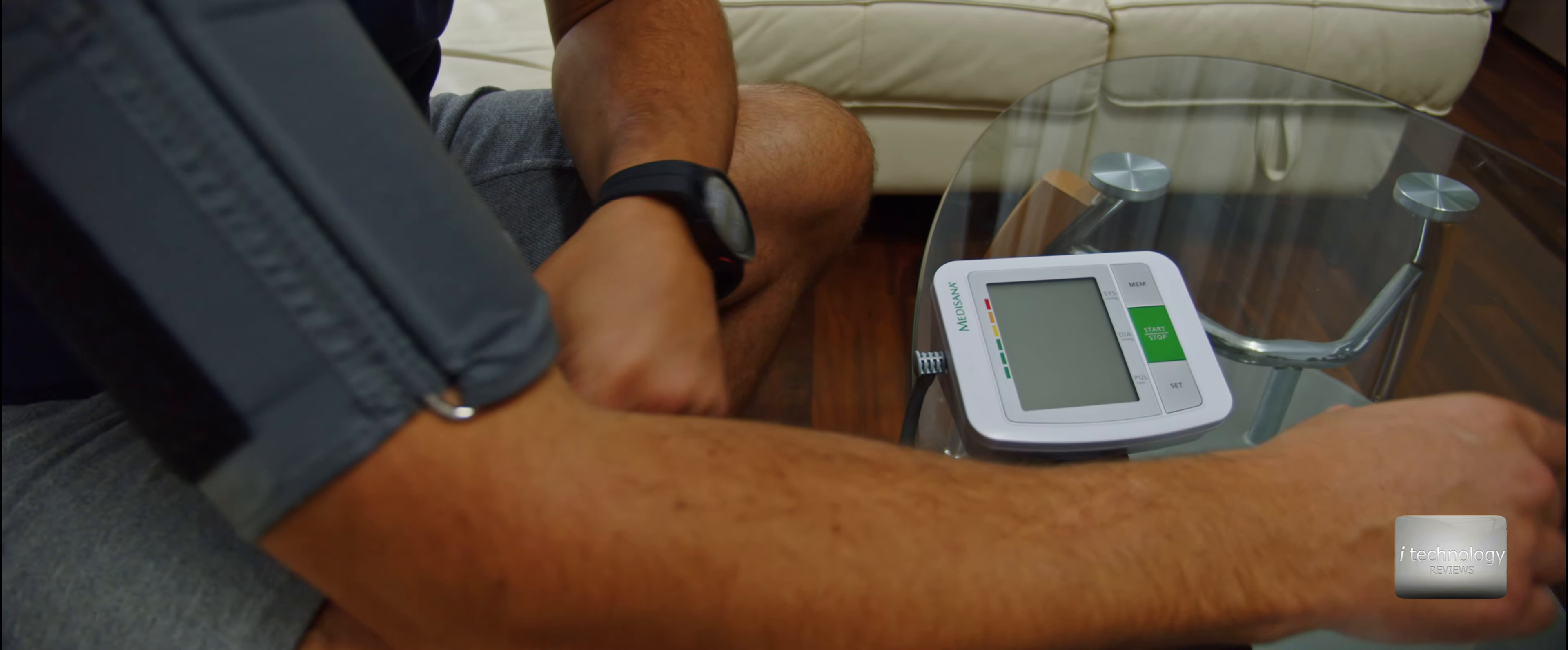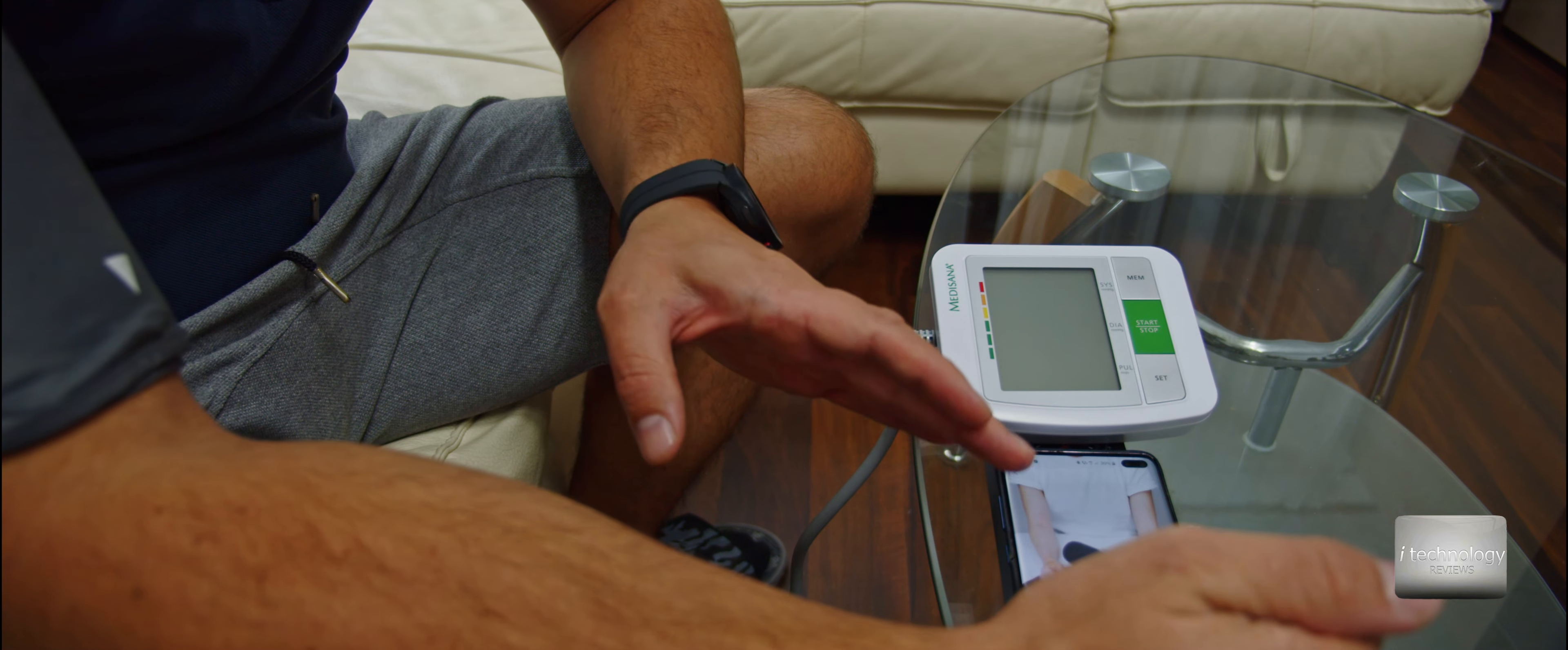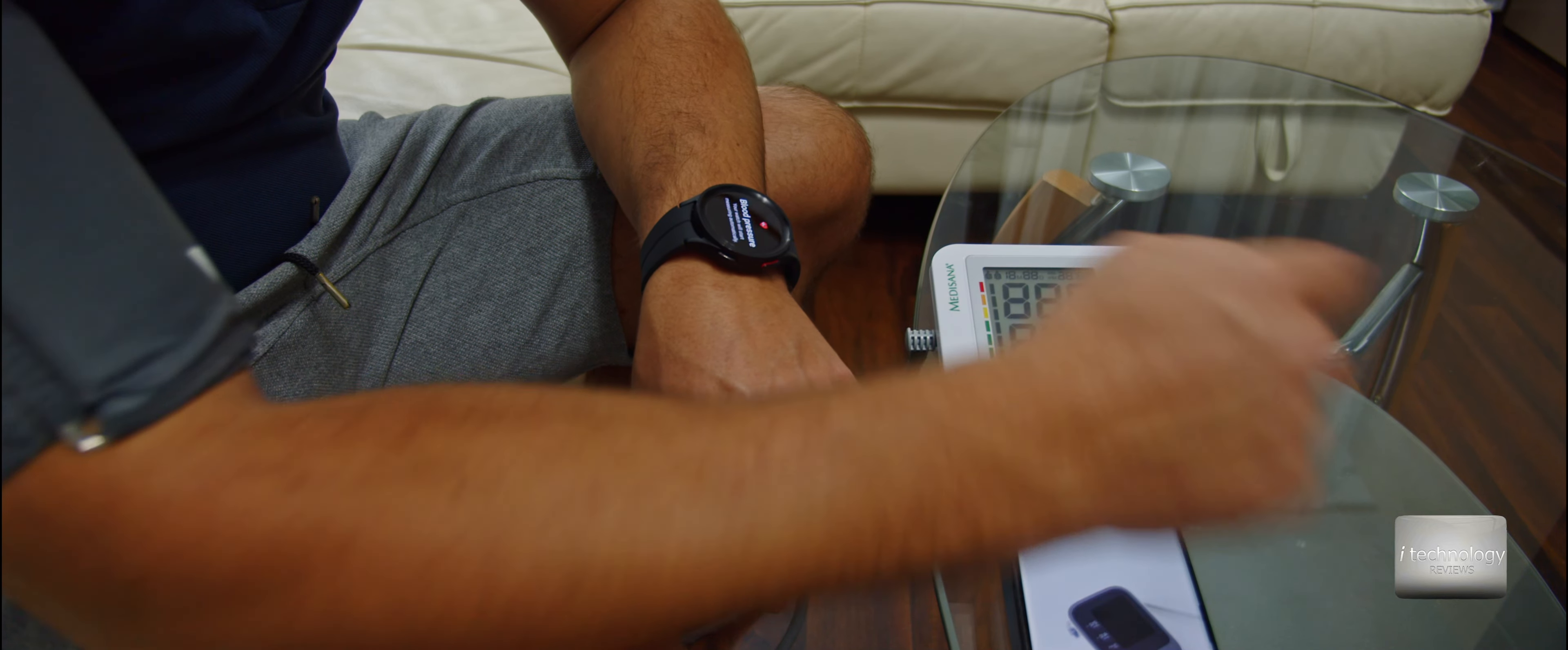You've got to leave your arm loose, do not hold anything in your arm, and do not talk or move during this measure. While you're making this calibration, you've got to be calm. Before this, don't do sport activities or drink coffee, because it will not be accurate. Click next, start your blood pressure monitor now.